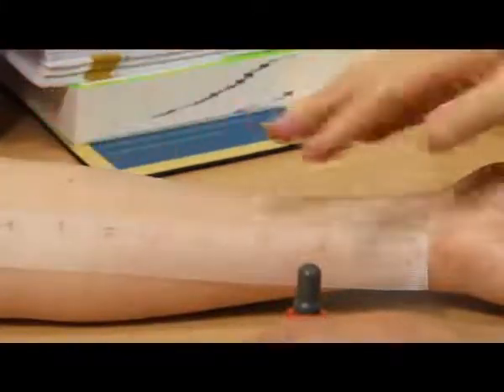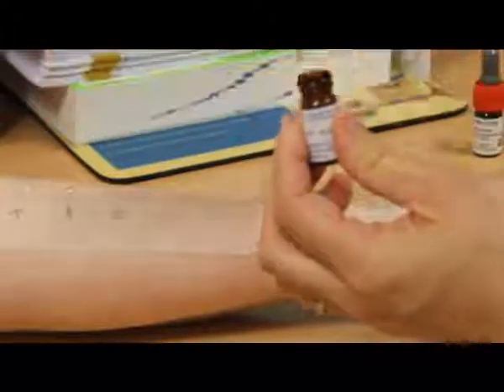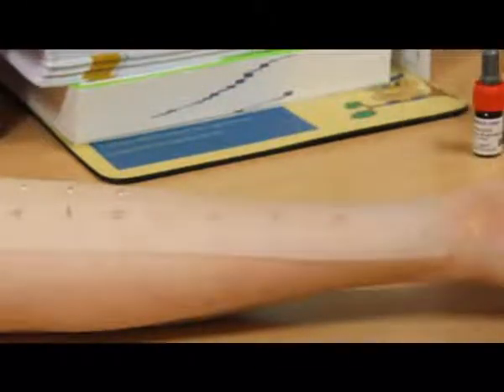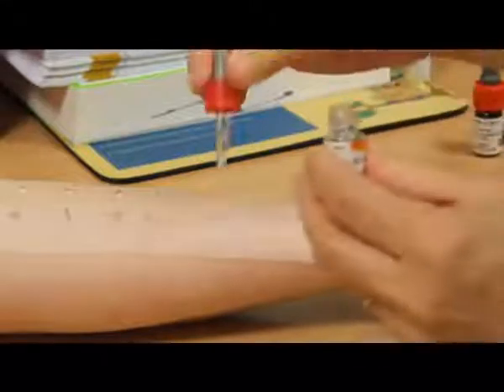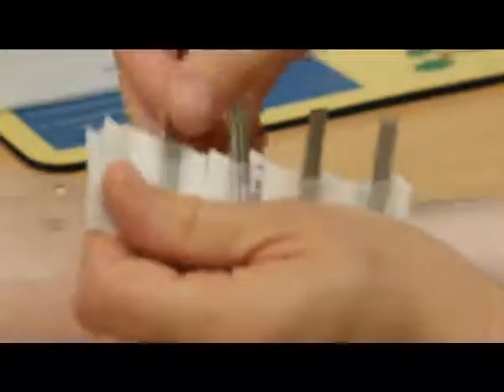So first and foremost I'm just going to pop a drop on this side. I'm not going to try and put all 14 on together. Just turn your arm just while I put the drops on, and then we'll be able to turn your arm again. So I'm just doing one. And then what I'm going to do is just pop the tiny little point on there and just give it a little twist. And that's as bad as it gets.